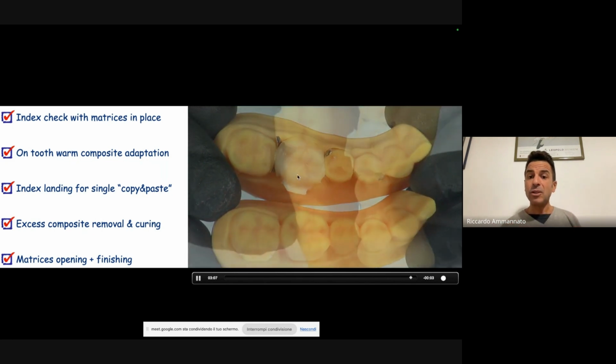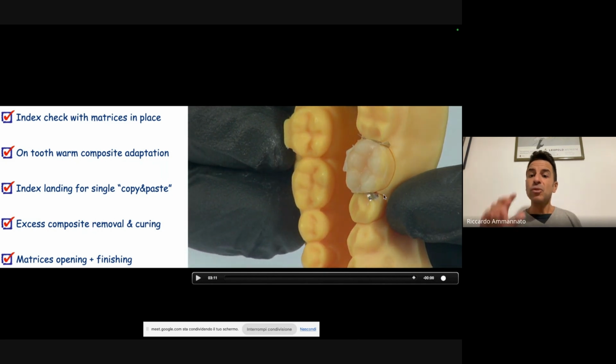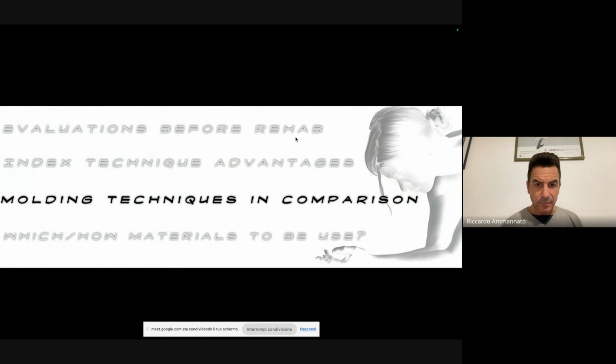And this was the project, and this is the copy paste. And again, what I want to highlight is that, due to the fact that we have a single index, the interproximal management of the finishing is fast, easy, and predictable. So let's go to the next chapter, the molding techniques in comparison.